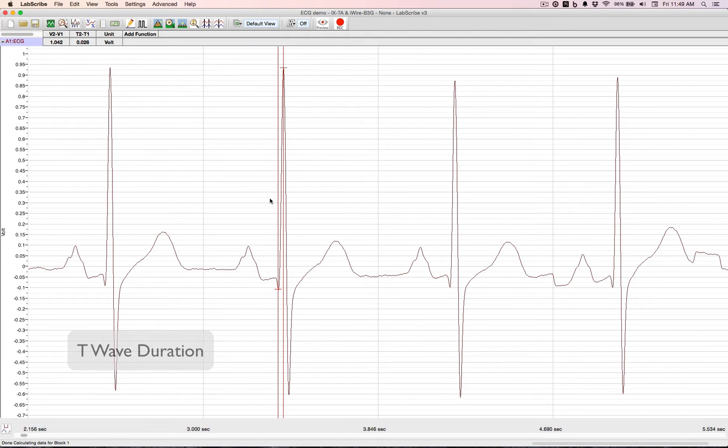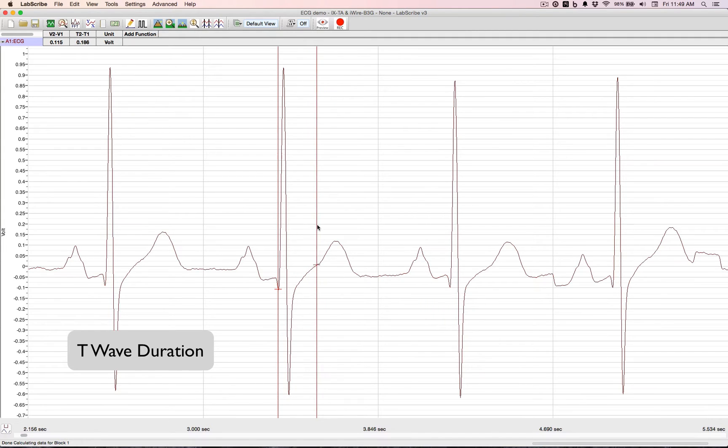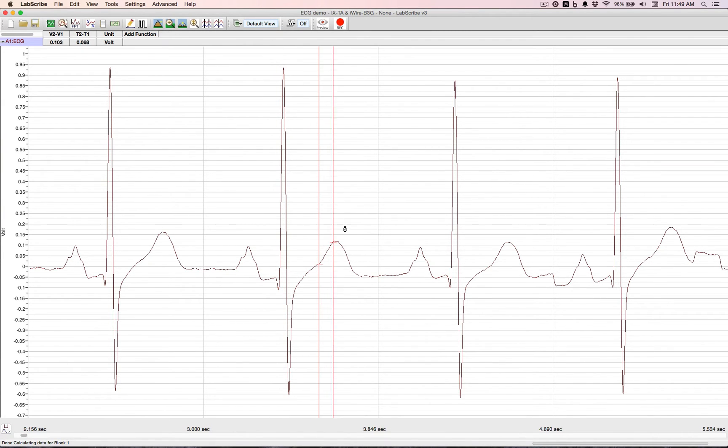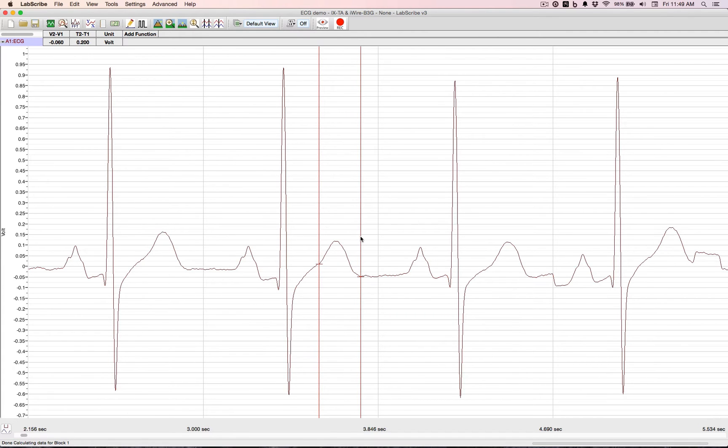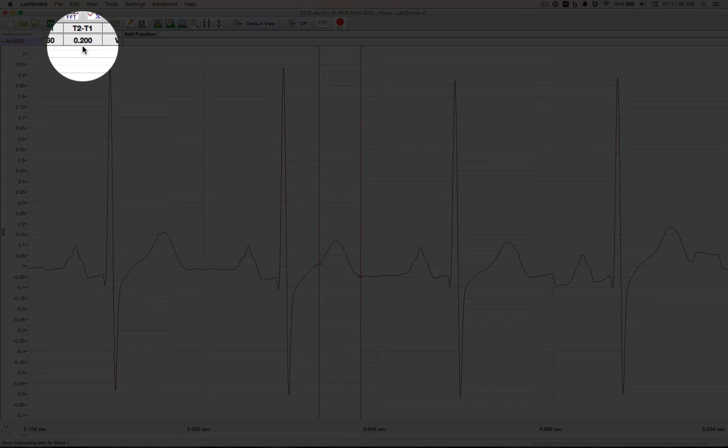Now, to do a T wave duration, we move it over to one side of the T. And the other side of the T. That's 200 milliseconds.